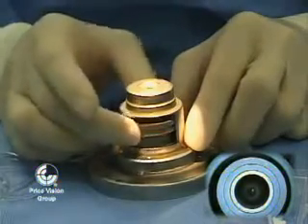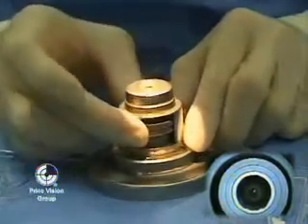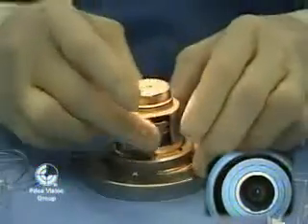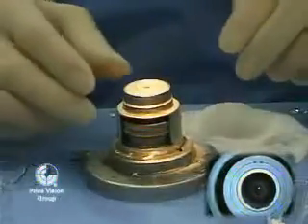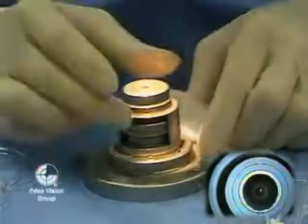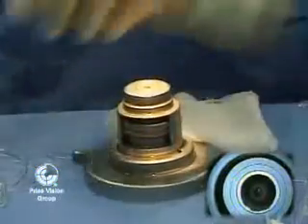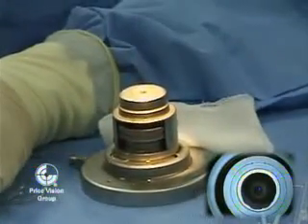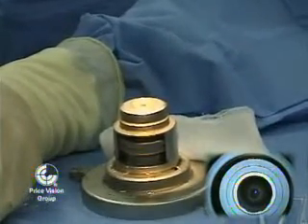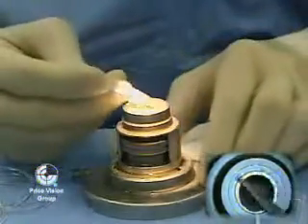Then we assemble the rest of the artificial anterior chamber, and now we're turning the mechanism within it to push the donor cornea up against the portion that locks it in place. So when we do this, we want to make sure that the donor cornea is centered on the center of the artificial anterior chamber, which essentially, when you look down on it, gives you a pupil. And that's real important because that's the center of your cut that's going to be made. And you really want to have your entire resected area be corneal tissue and not sclera.